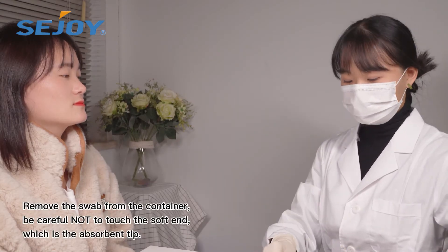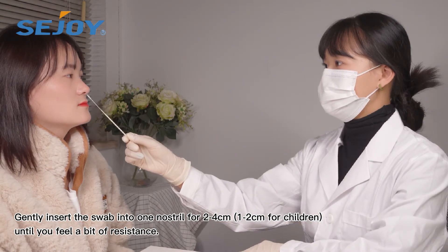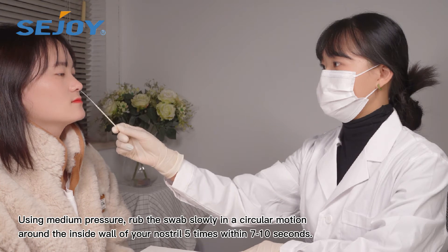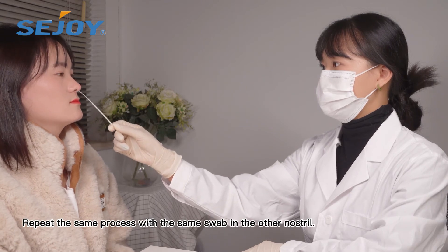Remove the swab from the container. Be careful not to touch the soft end, which is the absorption tip. Insert the swab into one nostril for 2-4 cm. Rub the swab slowly in a circular motion around the inside wall of your nostril 5 times. Repeat the same process with the same swab in the other nostril.